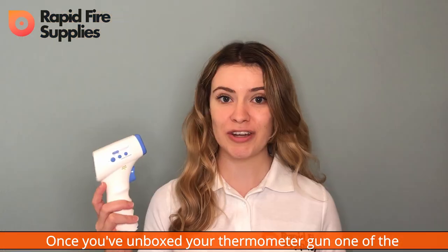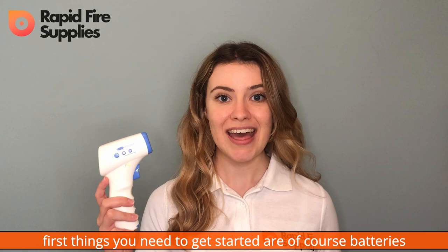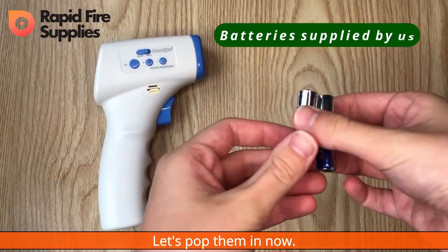Once you've unboxed your thermometer gun, one of the first things you need to get started are, of course, batteries. This device requires two AAA ones. Let's pop them in now.